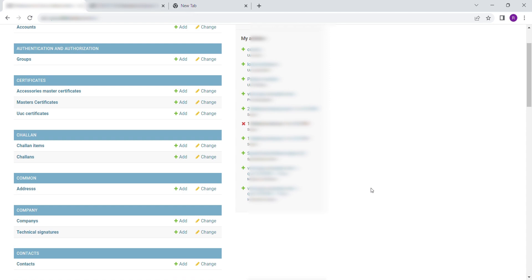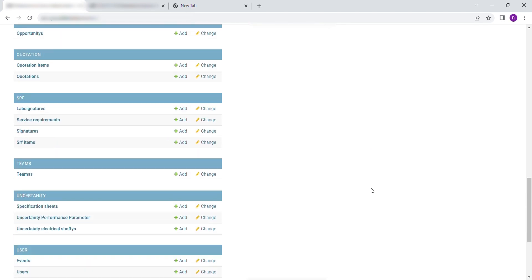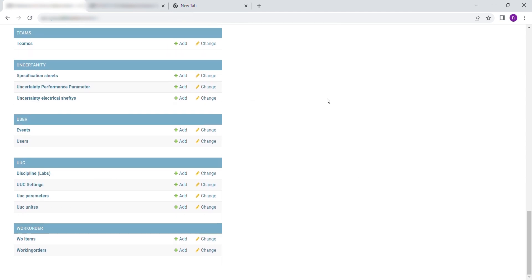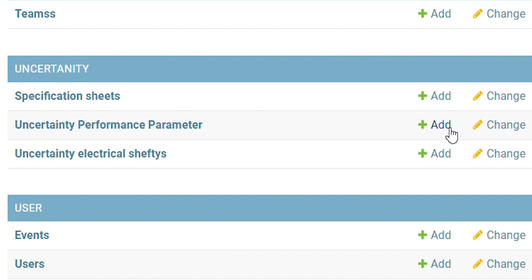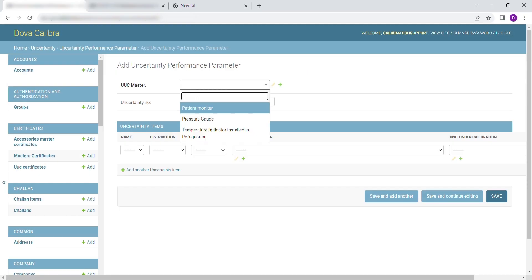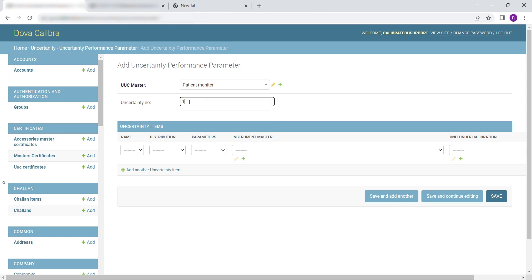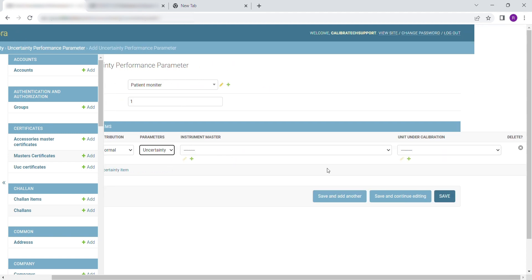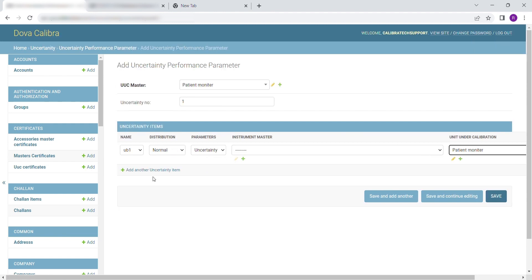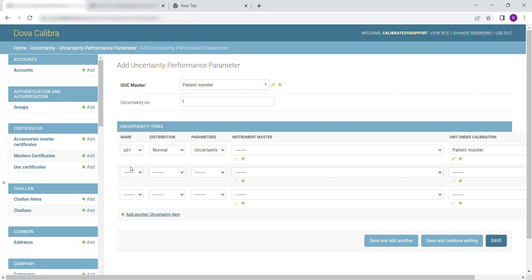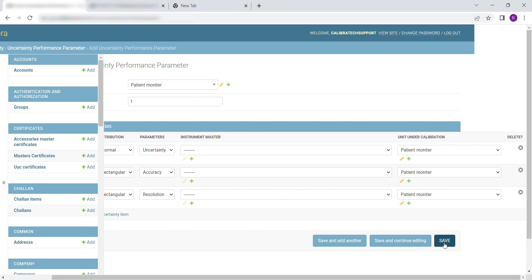To enter the Uncertainty Equation, scroll down to Uncertainty. Select Uncertainty Performance Parameter and click on Add. Select UUC Parameters from the drop-down. Enter the Uncertainty number. Select UB from the drop-down. Select Distribution. Select the Uncertainty parameter. Select Instrument. Select the Unit under Calibration. After entering the details, click on Save to save and exit, or Save and Add Another to continue.